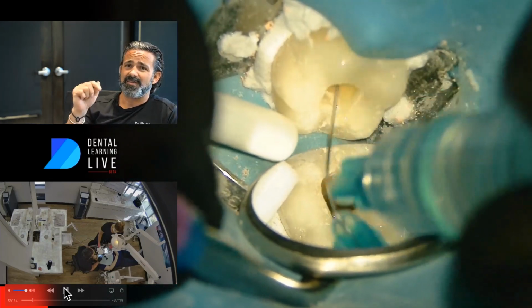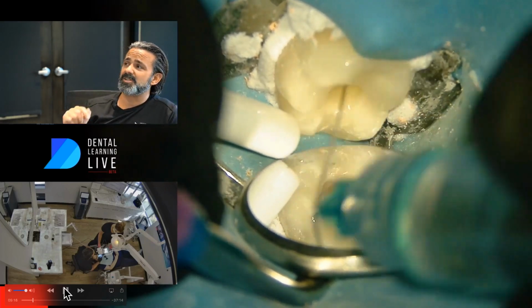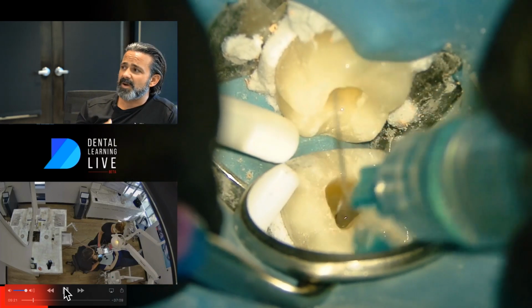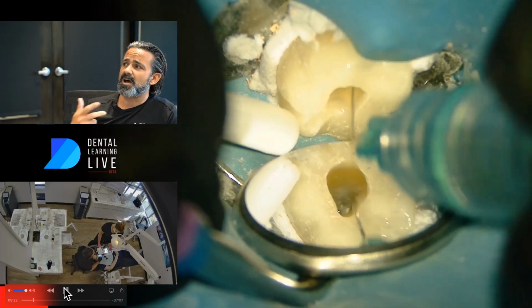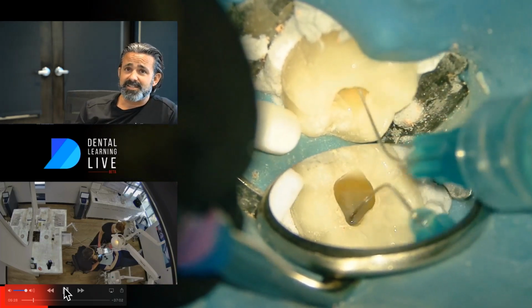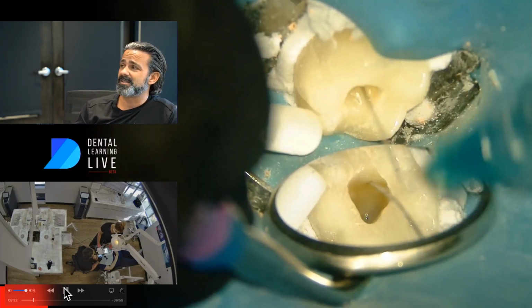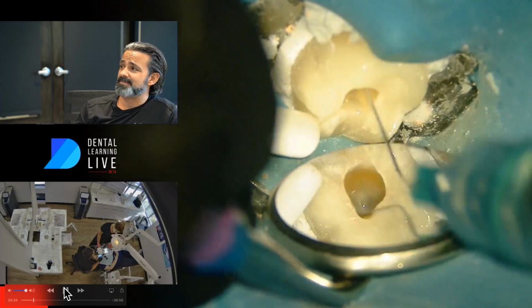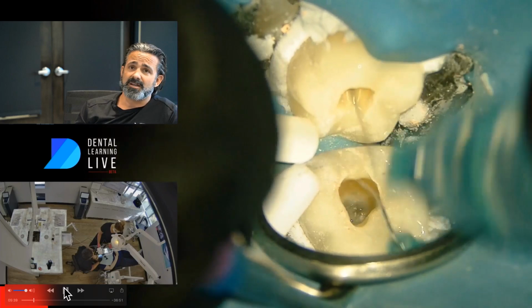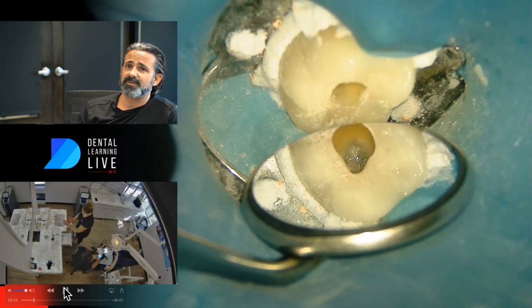So I'm just kind of poking it. This is a maxi probe, so it's got a round tip on it, and I'm just trying to pick at the gutta percha until it bites. And then once it starts biting, you'll find that this gutta percha really gets soft and soupy, and that's what's going to happen here. It's just a technique, a protocol that I like to do. It keeps you from transporting, and again, my mind is I'm making way for the GentleWave, and I don't want to smear or push the contents of the dental materials deeper into spaces inside that canal.